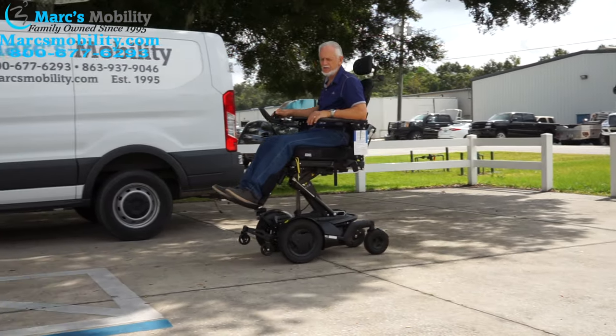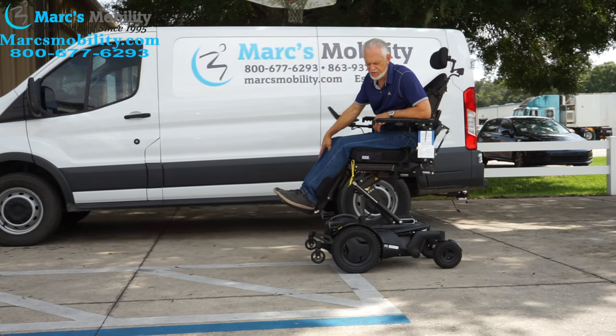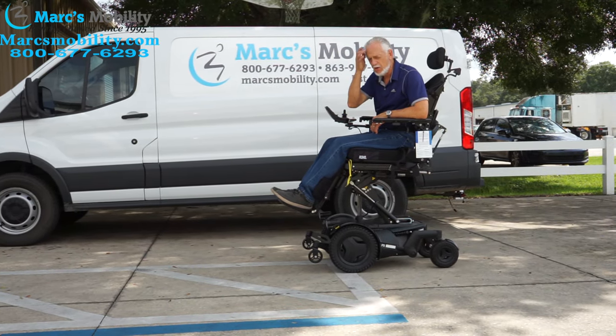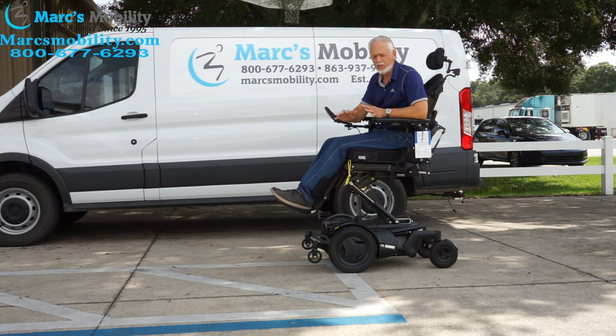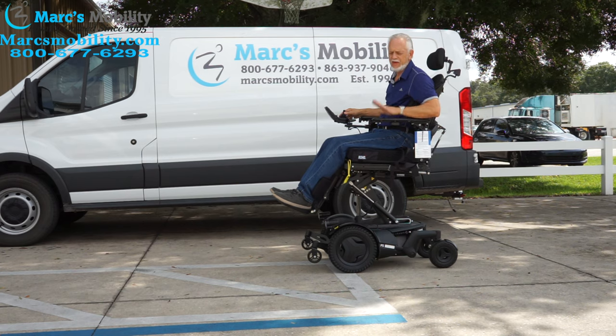When you elevate the seat, only do it on flat ground — don't go in the backyard with the seat elevated or you're asking for trouble. These are nice chairs but you have to take care of them. If you're looking for a chair with everything you ever want, the F5 VS standing power chair with two miles on it is one of them.